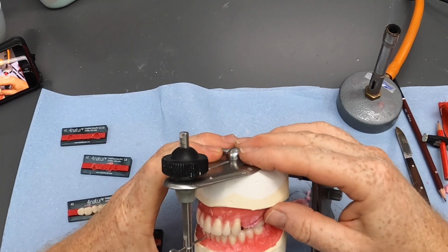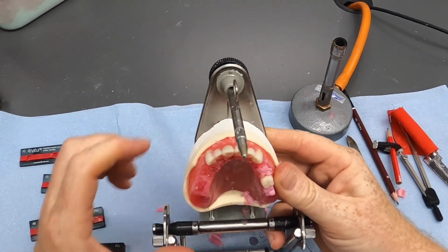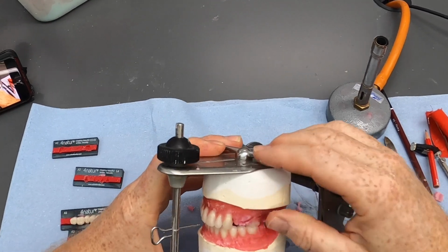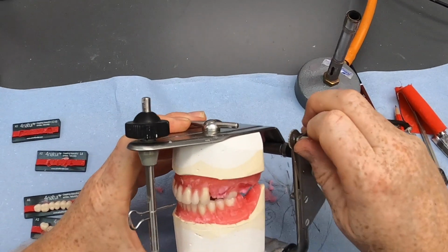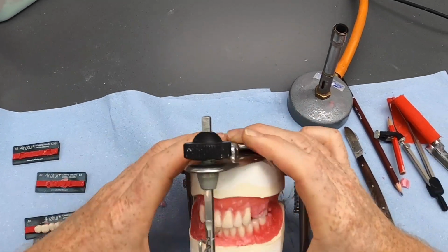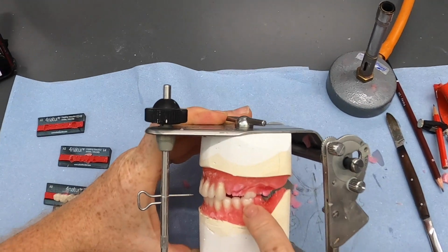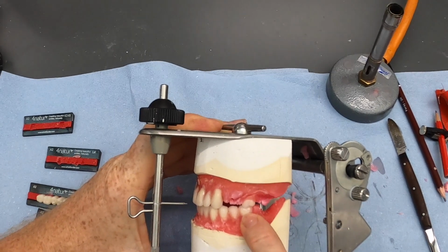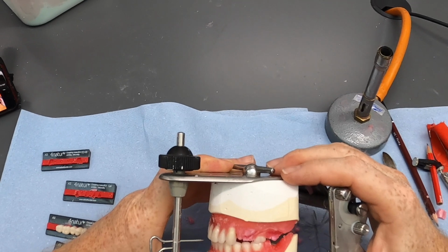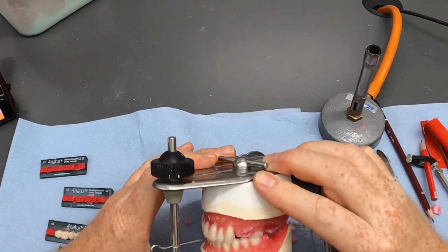So here we go then, going for that conventional approach. So we're putting the mesiopalatal cusp of the upper 6 into the central fossa of the lower 6. I'm just going to lock my articulator up for a moment just so I can get this contact nice without it wobbling all over the place. And you can see that we've got the buccal cusp hopefully lined up with the fissure in between the buccal cusps of the lower teeth. So class 1 if you like. Well, it is class 1.